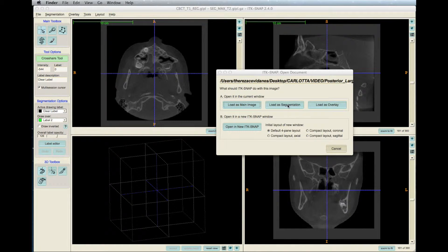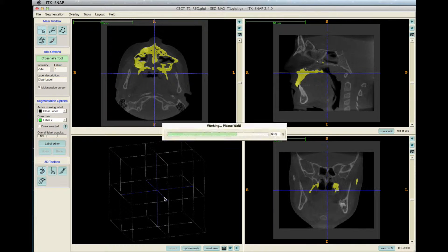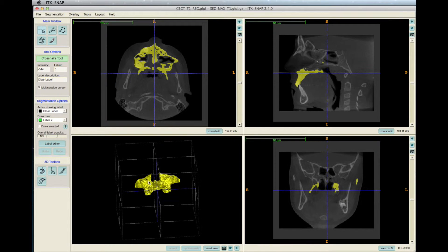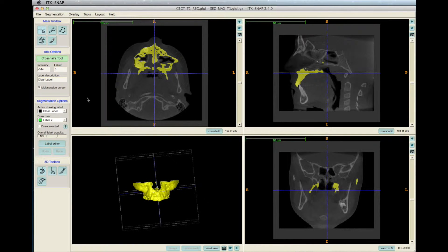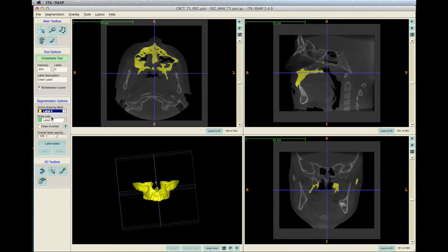Click Load as Segmentation. Click Update Mesh to see the 3D model of the maxilla. In order to make the segmentation thicker, change the active drawing label to yellow, as commonly used for the maxilla, and set the Draw Over option to All Labels.